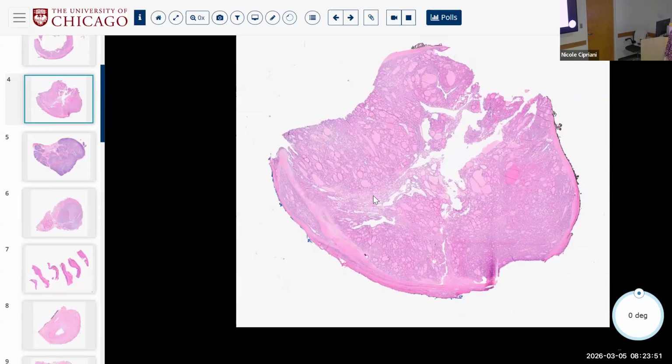Architectural features, right? So in both cases, there are features that either make us think about PTC, nuclei, features that make us think about FTC, capsule, or features of both nuclear and architectural irregularity. All of those are in this low-risk neoplasm category. They're all variations of so-called UMP, right? Tumors of uncertain malignant potential.